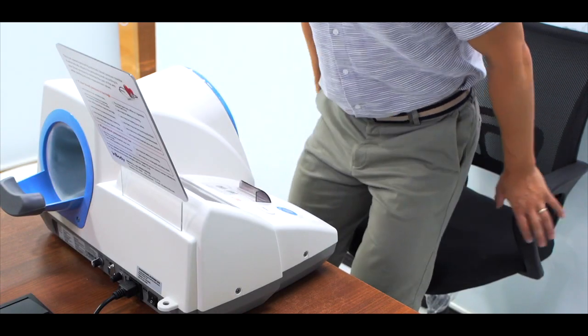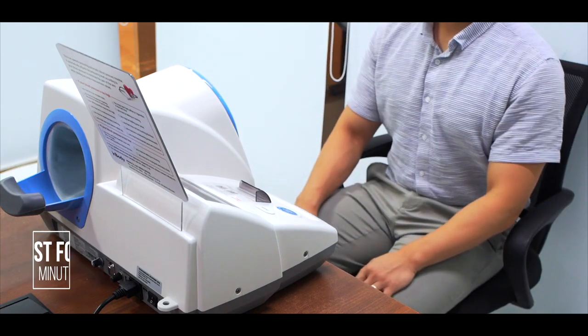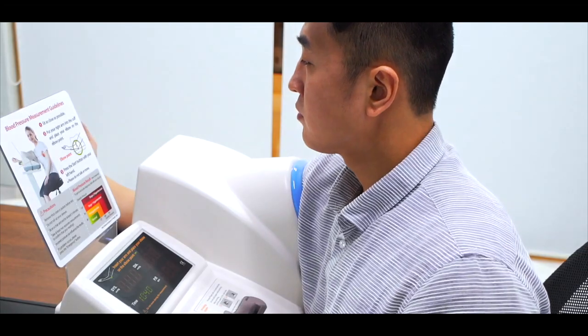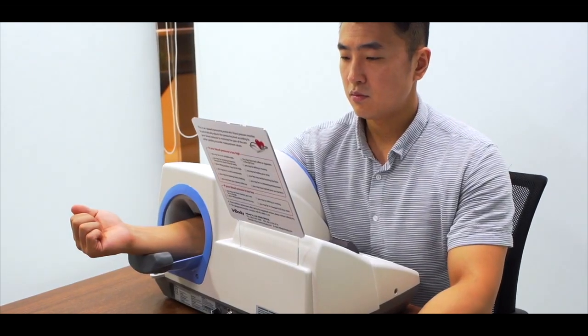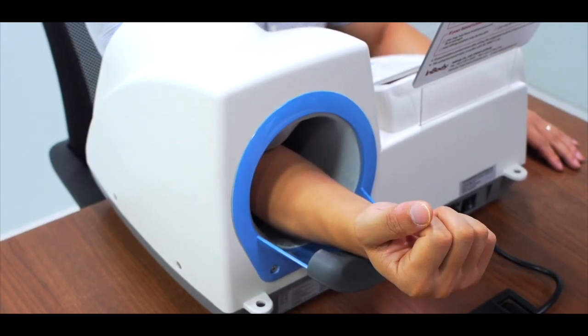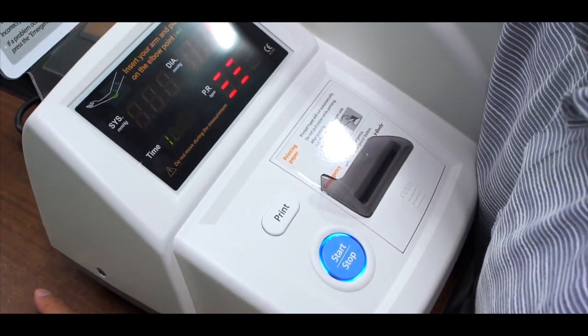Sit on the chair and rest for at least 5 minutes. Sit as close as possible. Put your right arm into the cuff and place your elbow on the elbow point. Press the start button with your left hand.